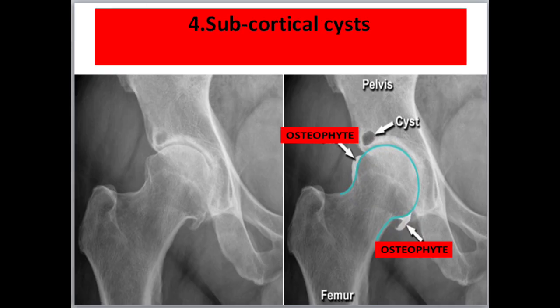Four: subcortical cysts. Although subcortical bone cysts are a characteristic finding of osteoarthritis, they are only visible in approximately one third of X-rays of osteoarthritic joints. This hip joint is narrowed and large osteophytes have formed. Note these cysts may be called subchondral cysts, subcortical cysts, or geodes — any of these terms are acceptable.